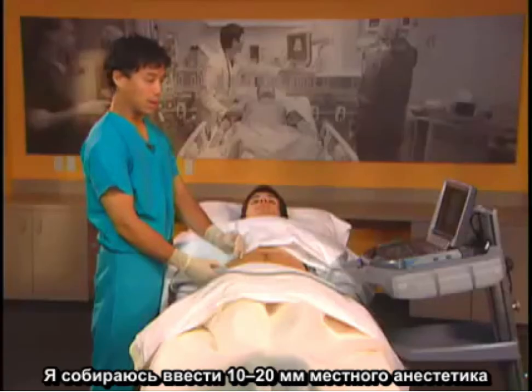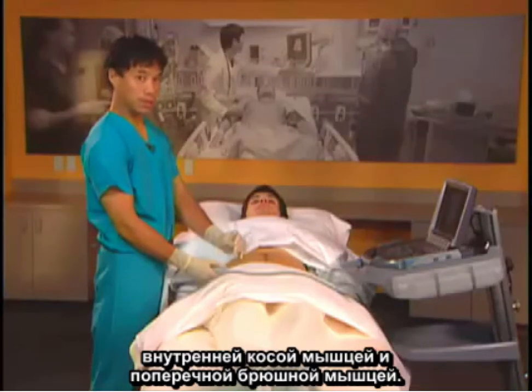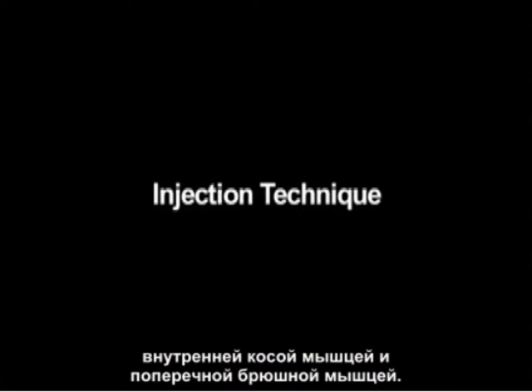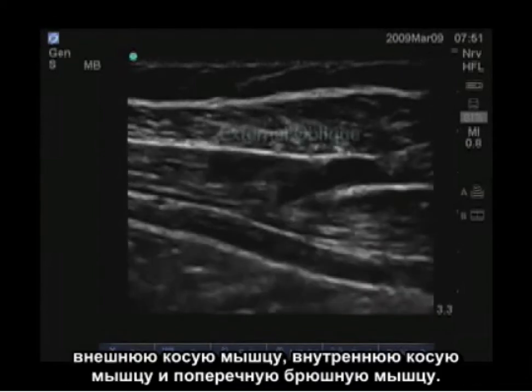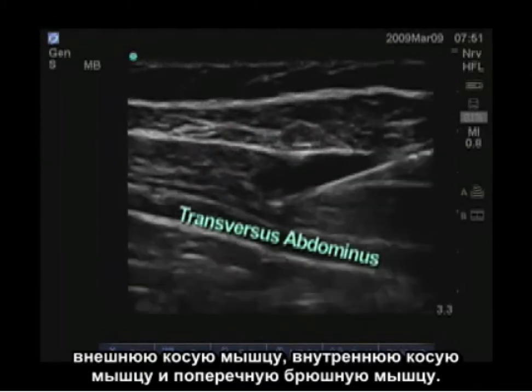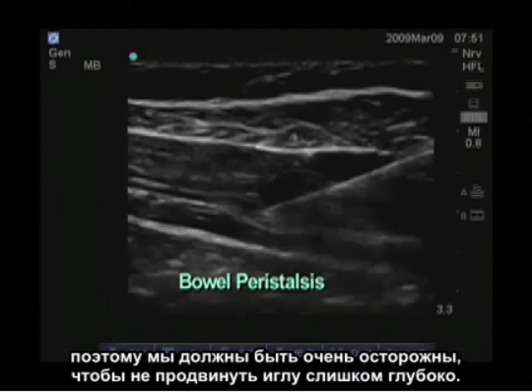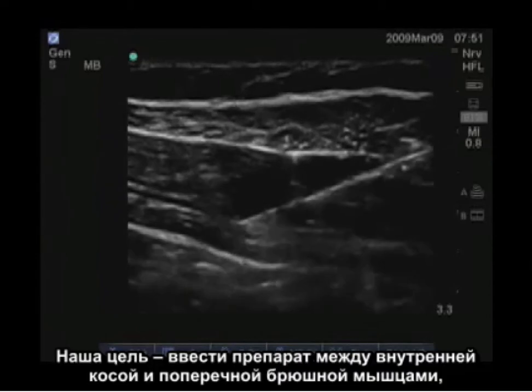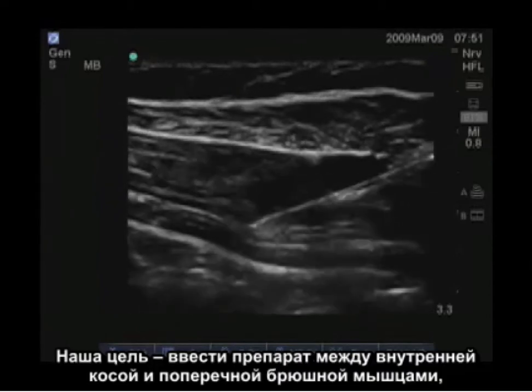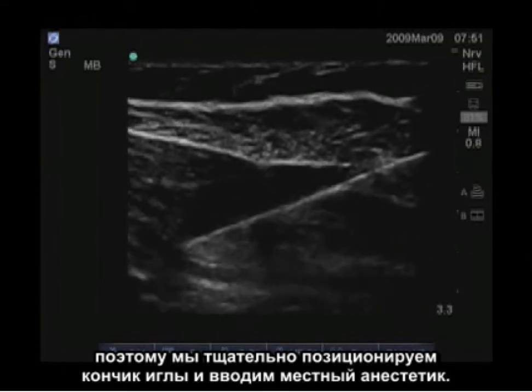I'm going to deposit local anesthetic between 10 and 20 milliliters between the two deepest muscle layers — the internal oblique and the transversus abdominus. In this image, we can see the three layers of the abdominal wall: the external oblique, the internal oblique, and the transversus abdominus. Below the transversus abdominus is bowel, and you can see that moving, so we want to be very careful not to advance our needle too deep. Our goal is to inject between the internal oblique and the transversus abdominus, so we will carefully position our needle tip there and inject our local anesthetic.